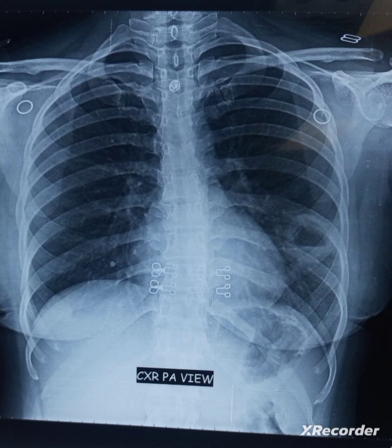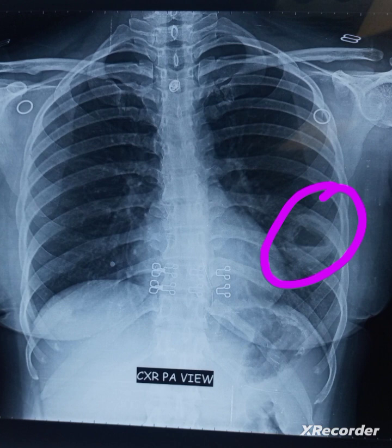In this chest X-ray, the abnormality you can appreciate is on the left side. If you focus on that, you can see there is an opacity with an air-fluid level. How would you define this? There is a thick-walled opacity with an air-fluid level. This is how you explain a chest X-ray — you should not go directly into the diagnosis; first you describe the findings and then you go to the diagnosis.